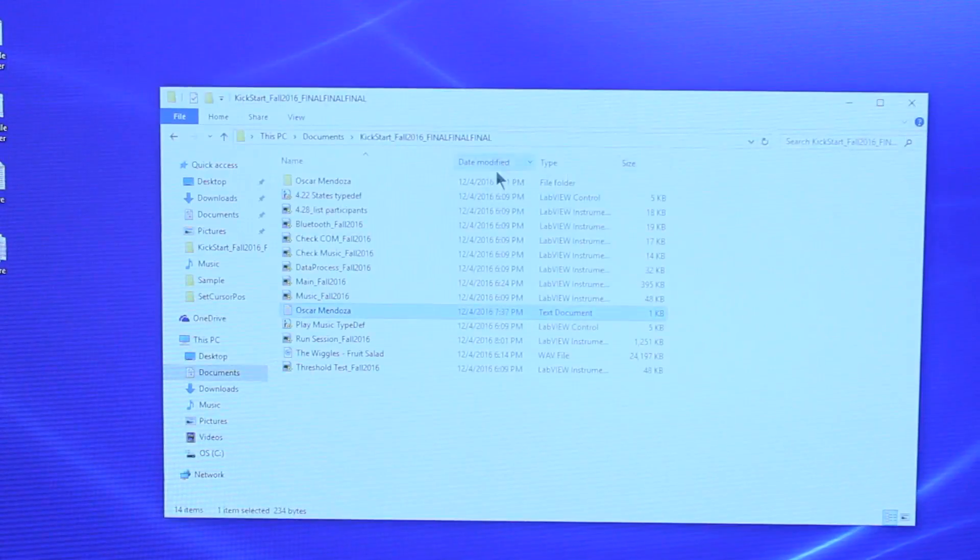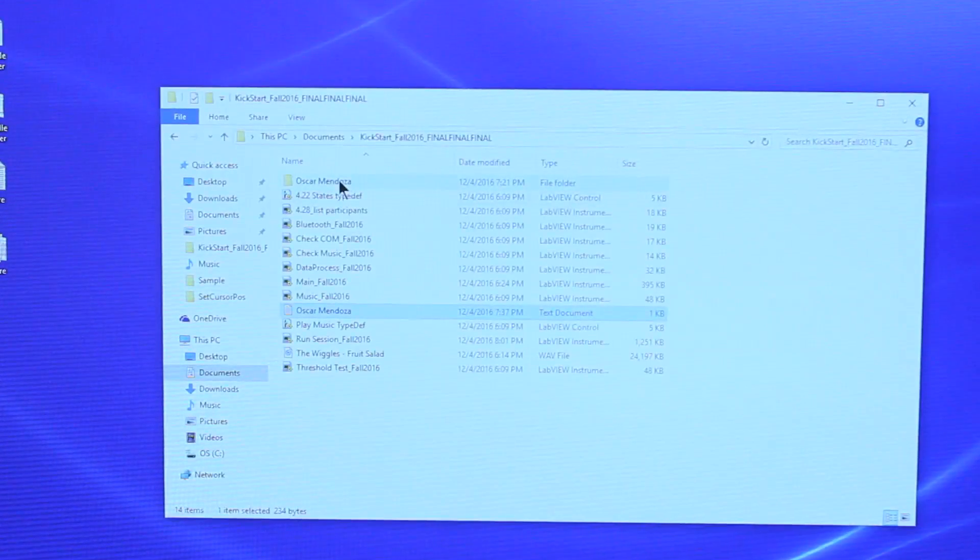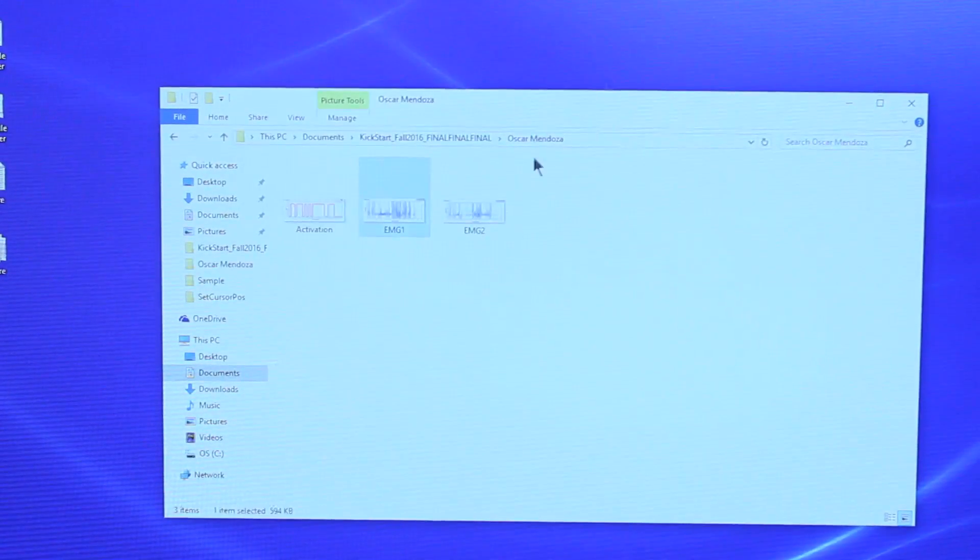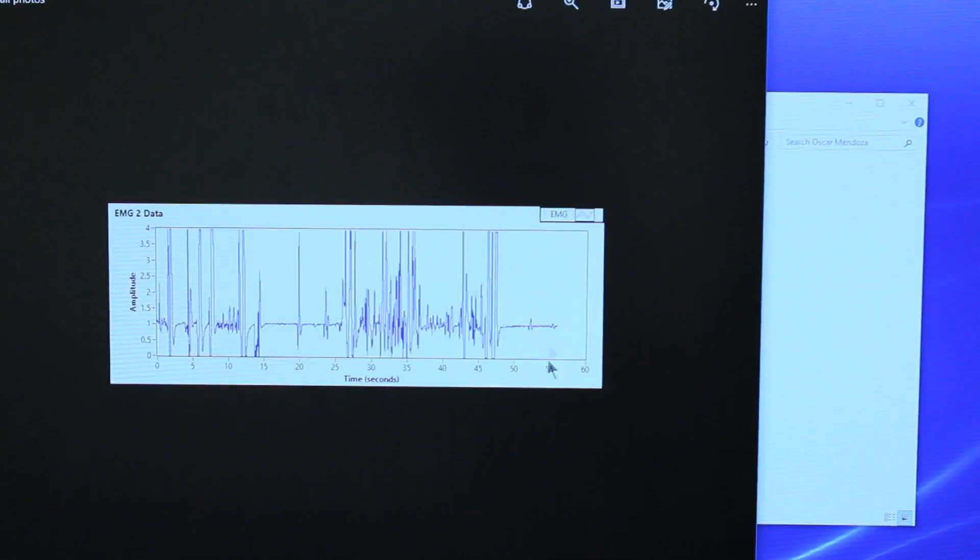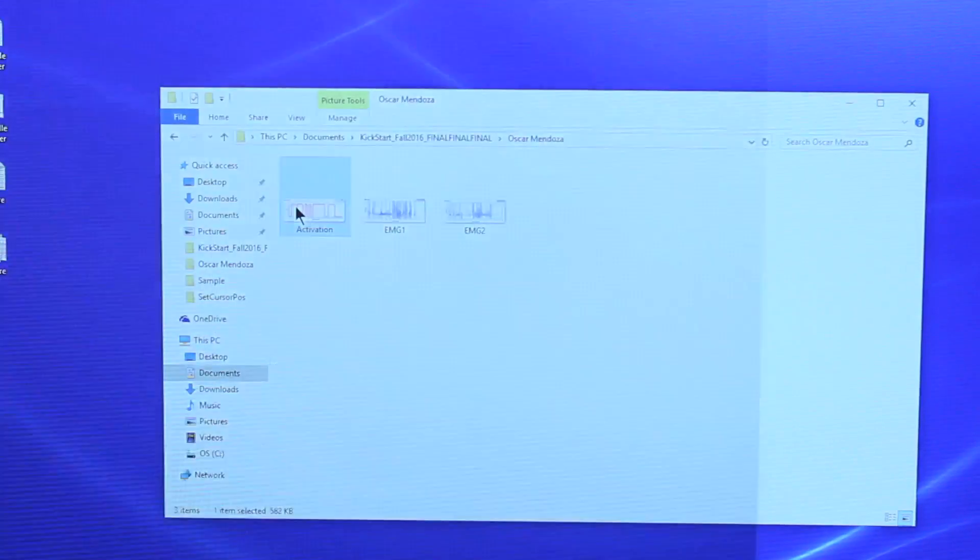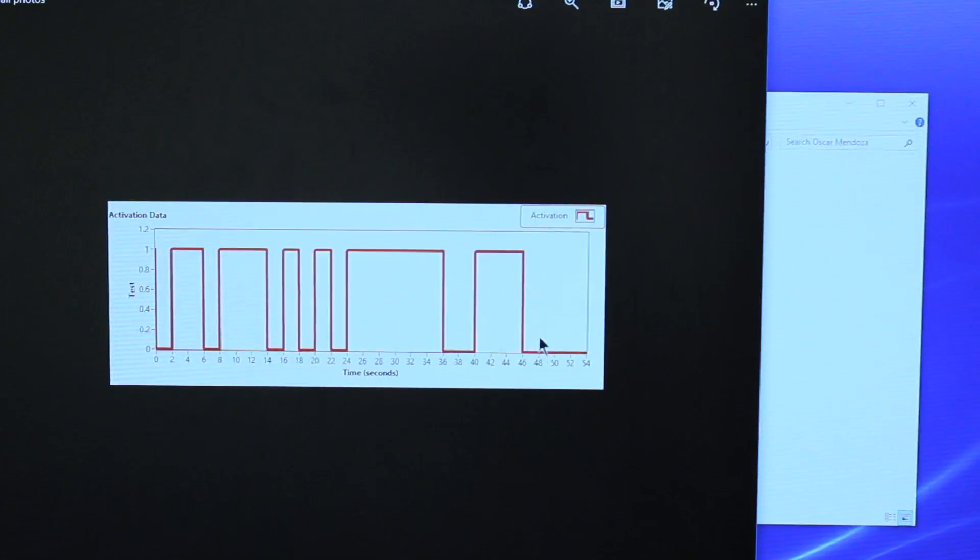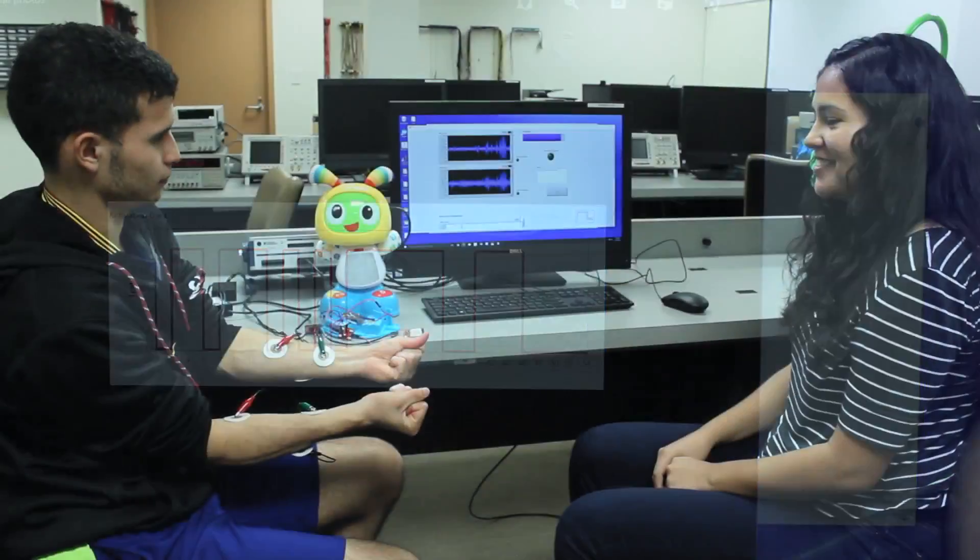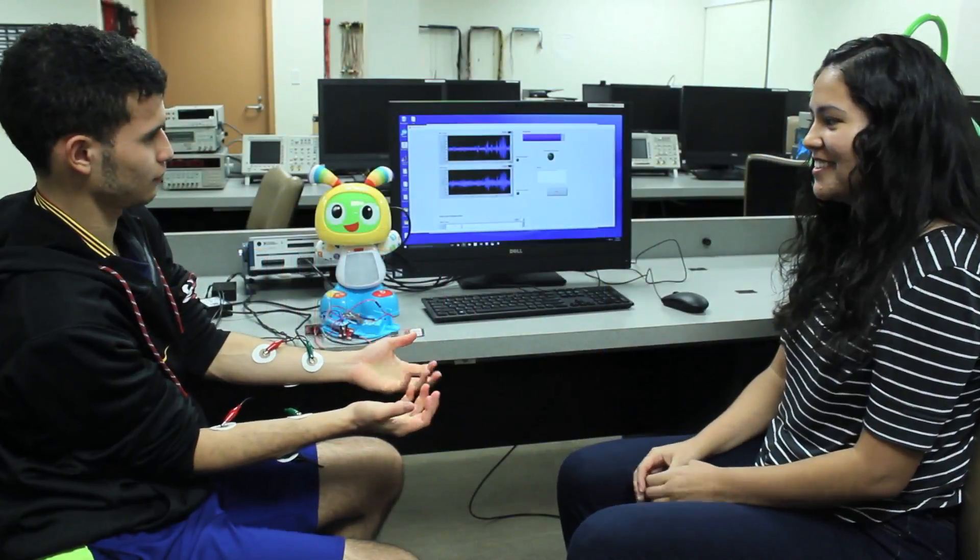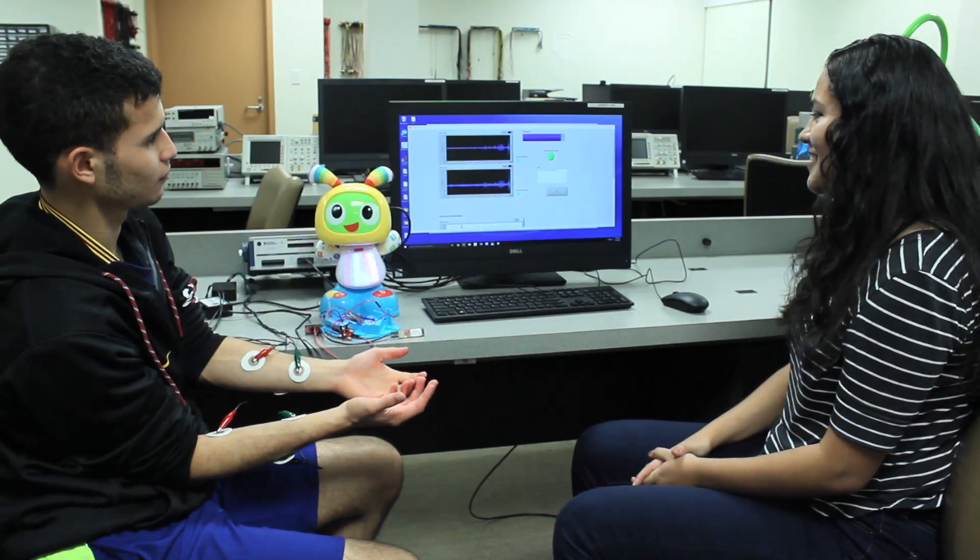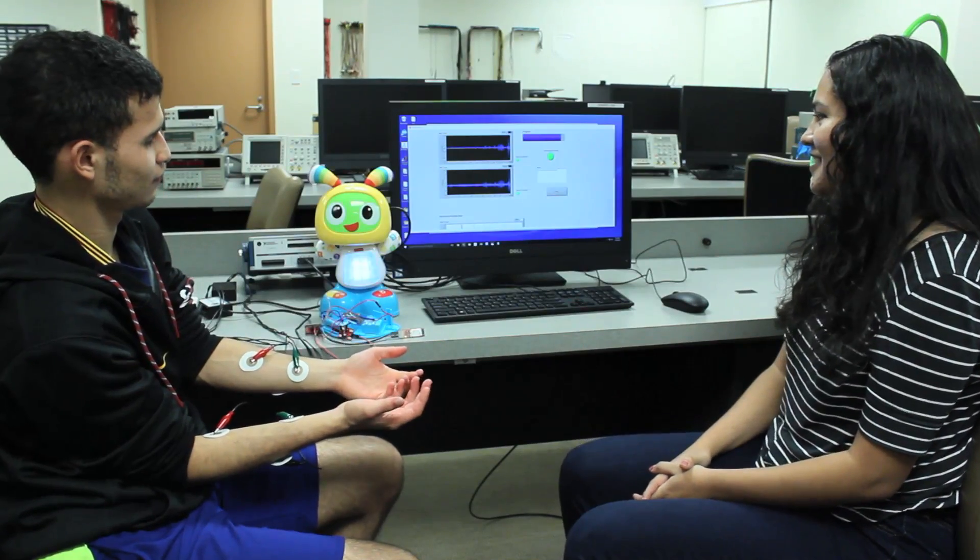There will also be a folder containing images of the graphs from the session. These graphs show the raw data of the EMG sensors, as well as an activation graph that allows the user to clearly see when during the session the toy and music were activated. Additionally, this Kickstart system can be used with multiple toys depending on which toy you connect to the Bluetooth COM port.